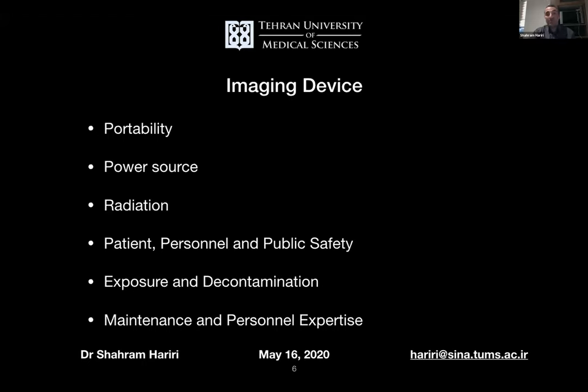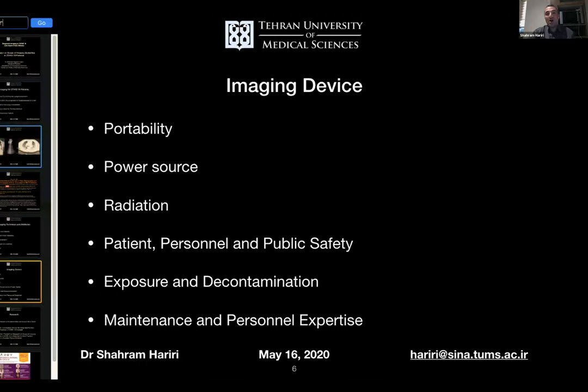These risks are related to patient transfer, exposure, contamination, and radiation. Justifying the risk of transmitting a high-risk COVID-19 patient from the ER to ICU radiology units, and the risk of contamination to this area, puts some weight on the portability of these devices.